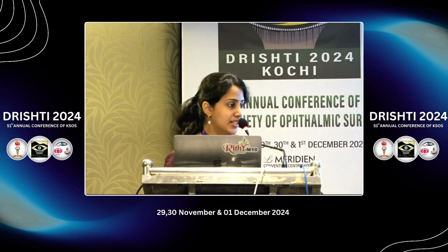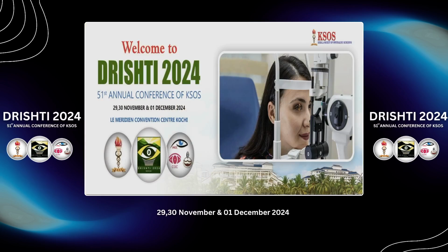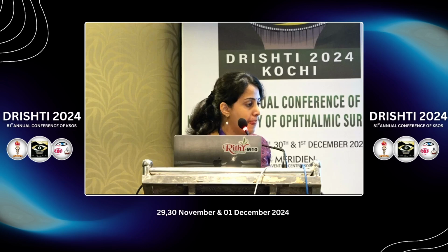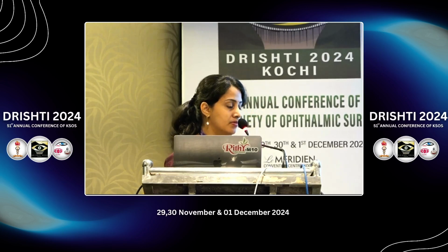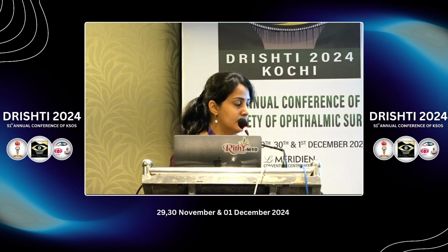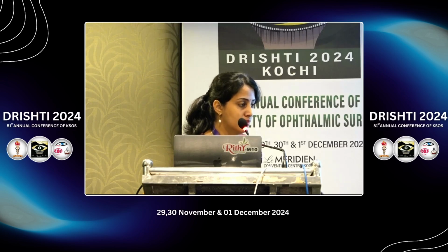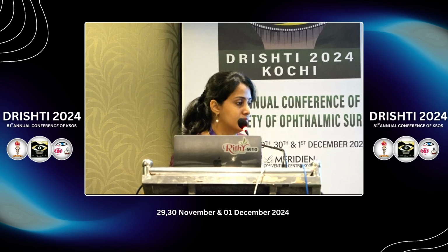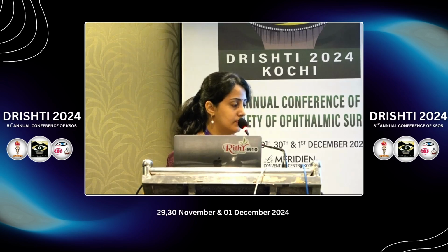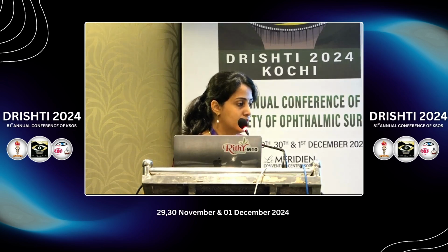Good. Thank you. I think there are many arms for this particular study. For example, the duration of glaucoma we don't know. So that is number one. Number two, reduction in FAZ, your foveal threshold will also change. That will be also a good parameter to study when you extend the study. When FAZ is becoming better, your foveal threshold in your 24-2 or 30-2, so that will give more value for this also.